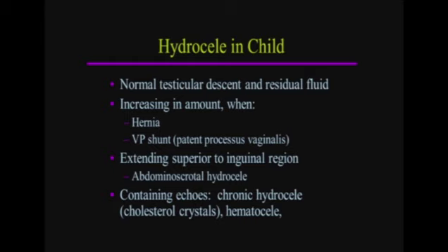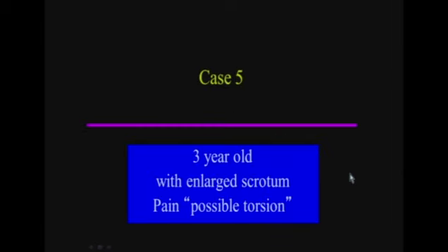And sometimes hydroceles contain echoes, as any fluid-filled structure. This may be because of chronic hydroceles, and it's said to be due to cholesterol crystals, but hemorrhagic, proteinaceous, or infectious material can also have echoes within a fluid-containing area.